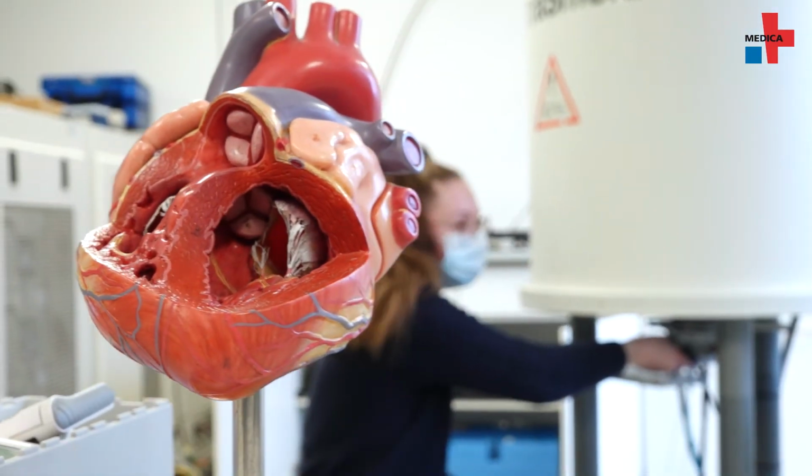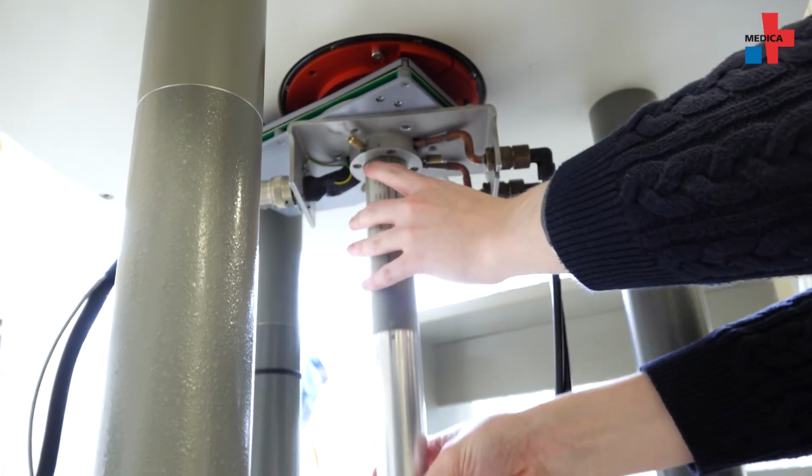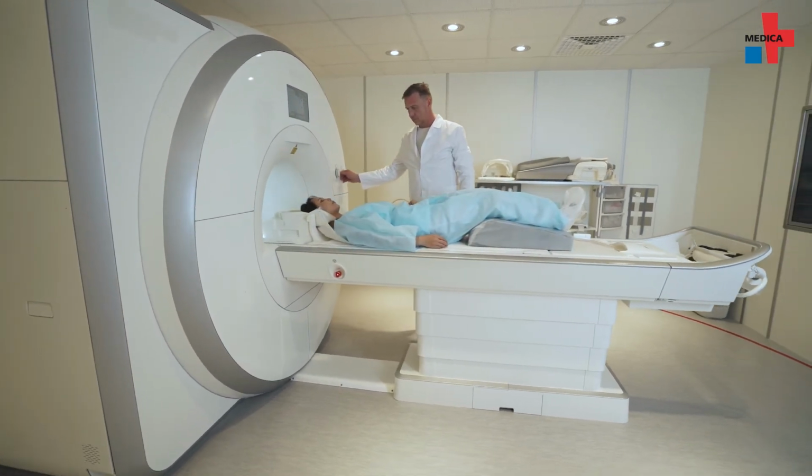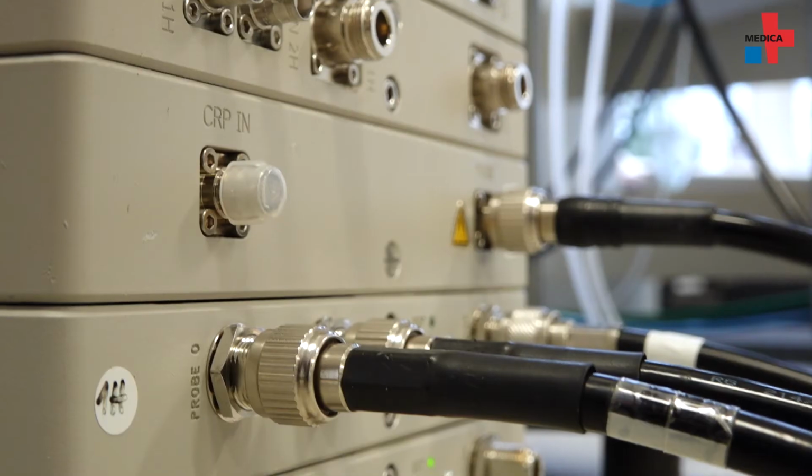From the researcher's point of view, application in humans would theoretically be directly feasible. From a technical point of view, the approach can be easily transferred to the clinical setting, since fluorine coils can be mounted to each clinical scanner. From the pharmaceutical point of view, clinical studies from phase 1 to phase 4 have to be carried out, which have to show the safety of the pharmaceuticals and the contrast agents. And let's see, this will definitely take some time.